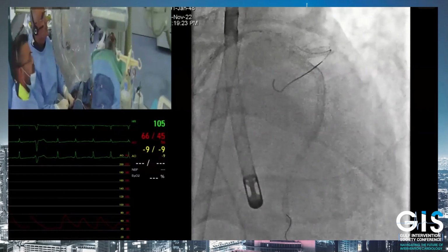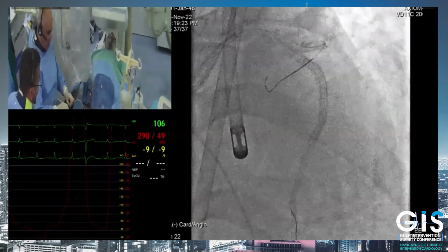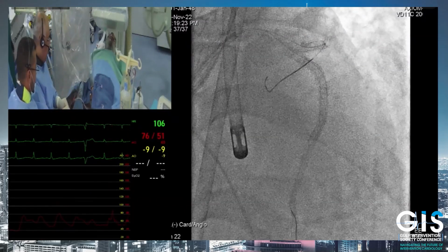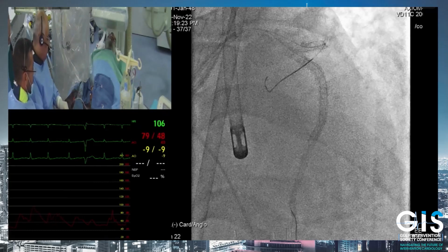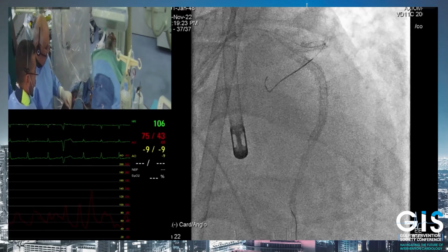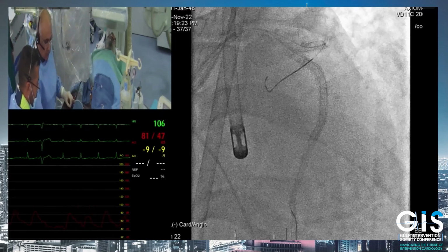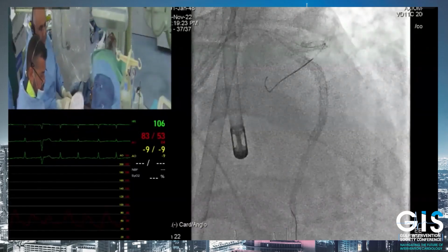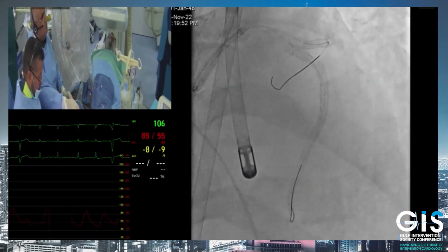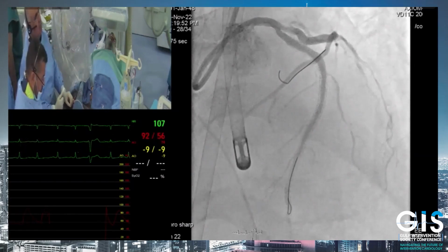It's ready. We're ready. Abdullah, when you do provisional stenting across, like the left main, do you go and open the struts to the circumflex? Yeah, so I think it depends on the acuity of the situation and on the ostium of the other branch. Those are all factors that play into the decision. Sometimes if it's an acute coronary syndrome, then try to maybe keep it minimalist and then maybe optimize later on once the situation is more stable.